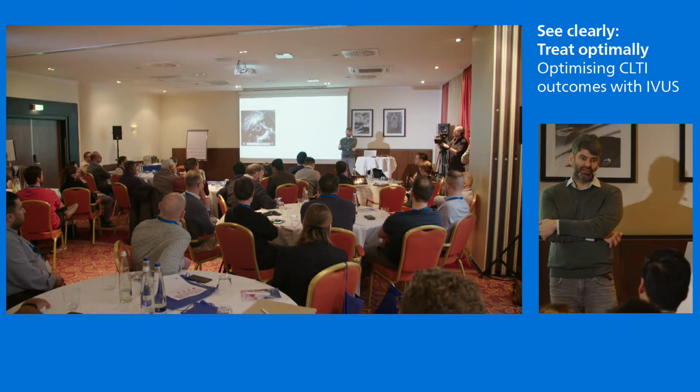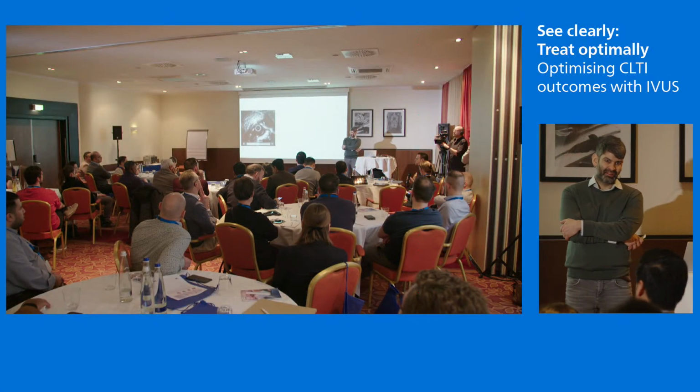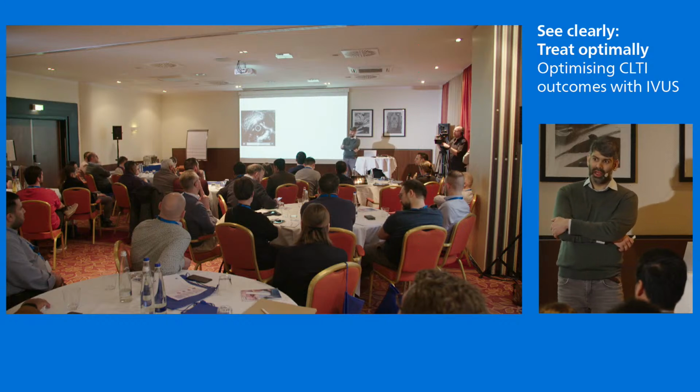In Germany, IVUS is not yet reimbursed, but I hear that that may change soon. So is there anything that people may feel, okay, well, this specific high-risk case, it's going to give me some information that even without the reimbursement, I'm going to open it? I would argue that the complex lesions in critical limb ischemia patients with advanced wounds, these are going to be expensive patients anyway, and you want to be sure that you're opening the right expensive devices that are going to be the right treatment for them, and that's probably where the cost saving will be more realized.